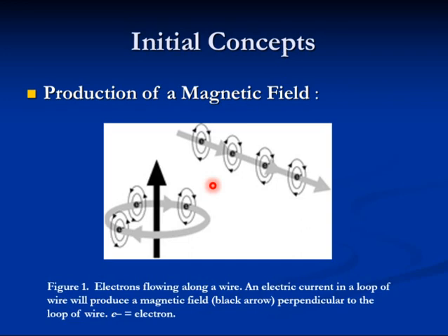The most important thing. Now, by the way, MRI stands for magnetic resonance imaging. Okay? Originally, when they first invented it, the more scientific name for the MRI was NMR, nuclear magnetic resonance. NMR. Okay? Why did they change it? Because the patients were afraid.